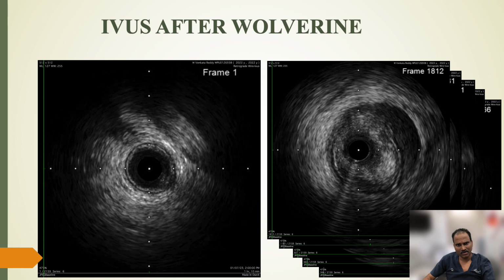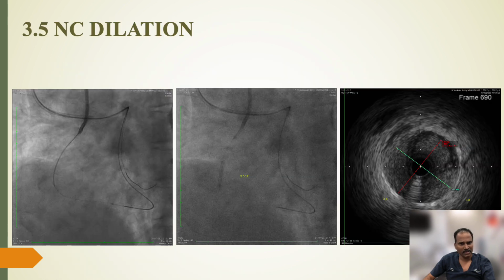So we decided to go ahead with the NC dilatation, and that's the maximum NC which is allowed here.